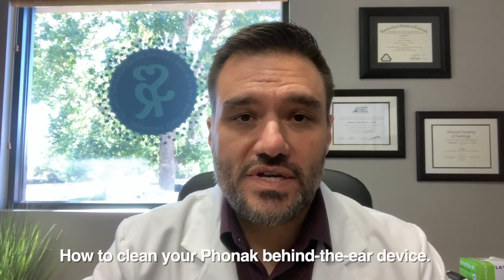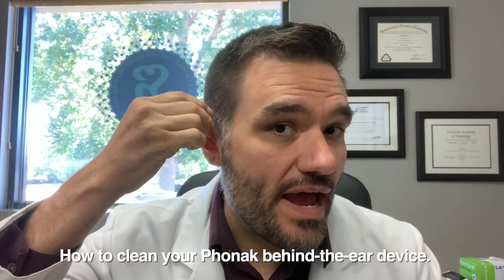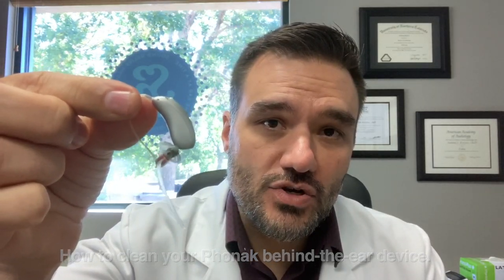Hi, this is Dr. Tony Kovacs at Sound Relief Hearing Center in Fort Collins, Colorado, and today we're going to cover how to clean your Phonak behind the ear device.